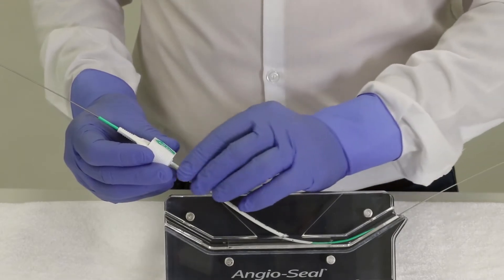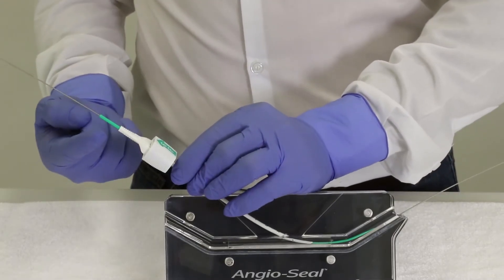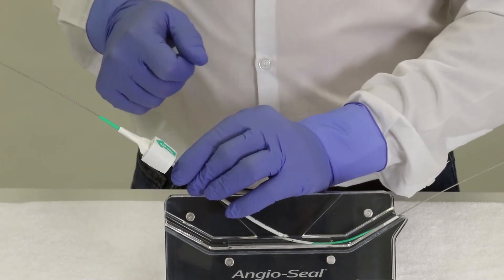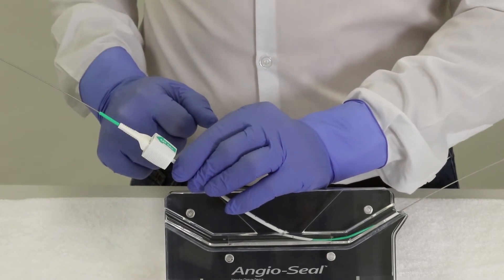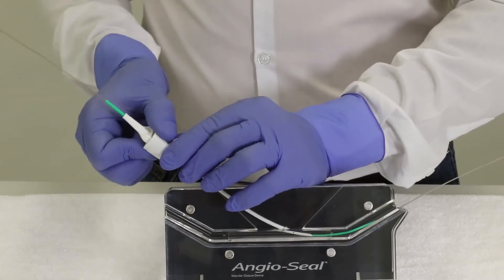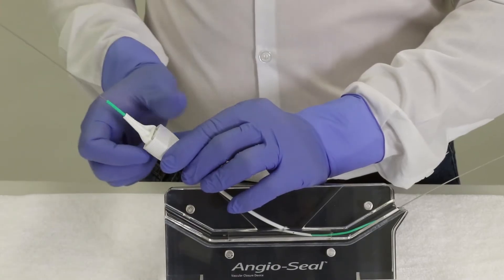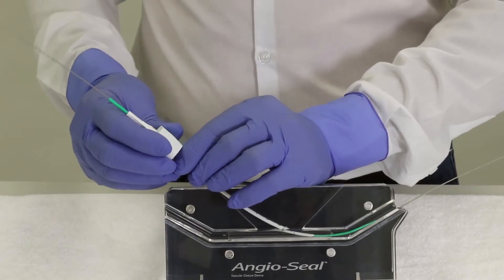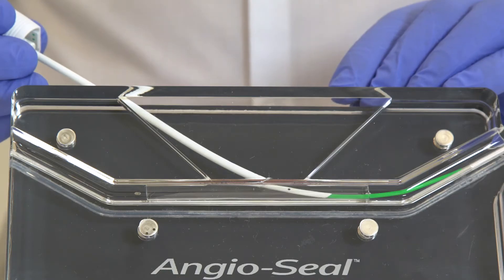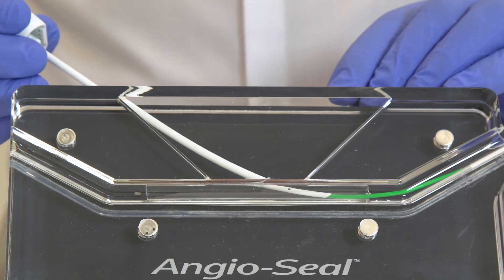There's a small hole at the proximal end of the dilator. As long as you have the green arrow on top pointing up, that hole is pointing down and it will cause pulsatile flow downwards. If you have this inverted you could get it in the face, so be careful with that. Once you have pulsatile flow, that means you located the artery and the holes in the sheath and dilator are inside the vessel. We don't know how far in we are, so we gradually take the device out until we lose that pulsatile flow.